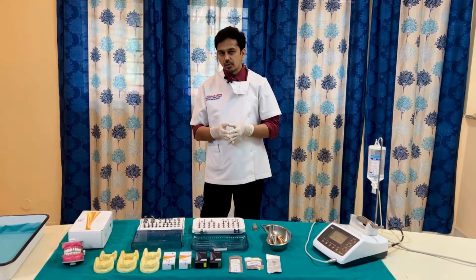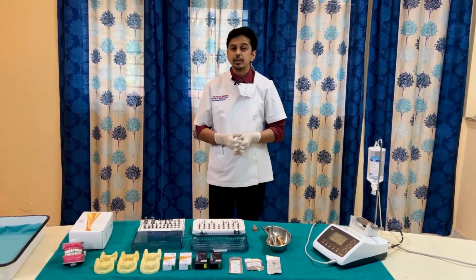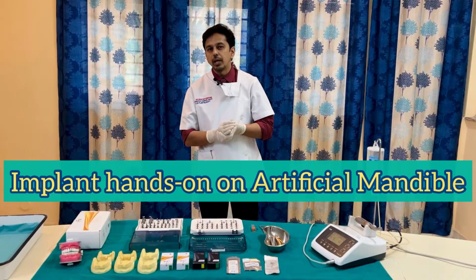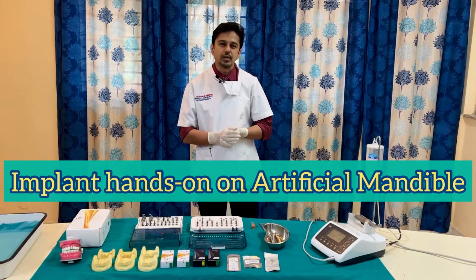would be a continuation of our earlier video. So if you remember, in the earlier video we had demonstrated various types of implant kits, physiodispenser, significance, etc. Now in today's video we'll be giving you a hands-on demonstration of implant placement on artificial mandible.